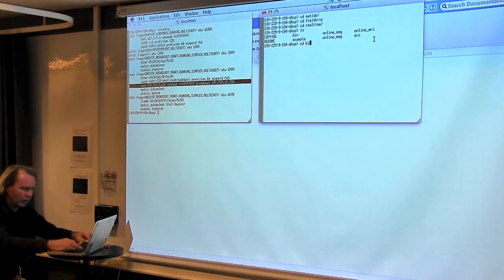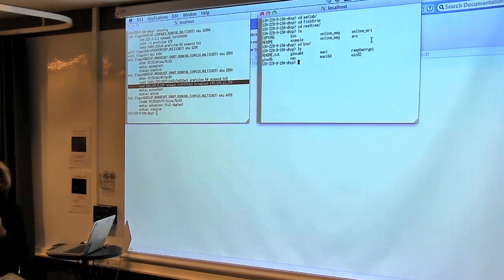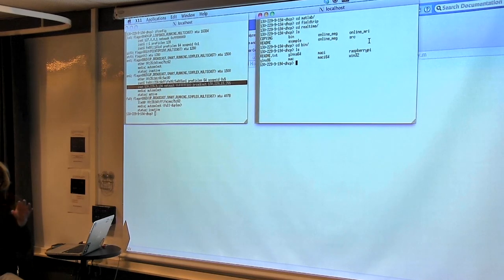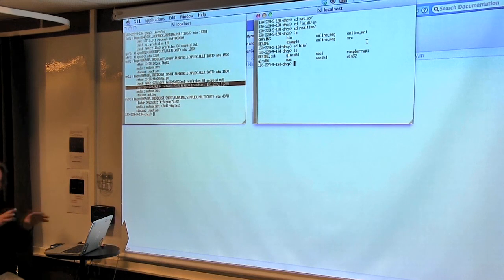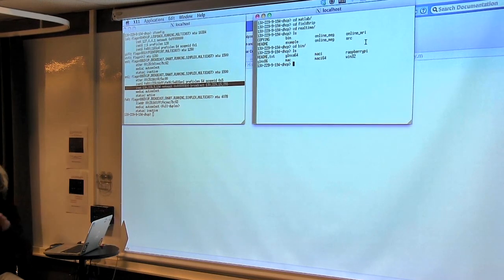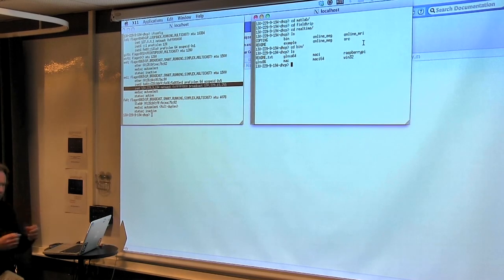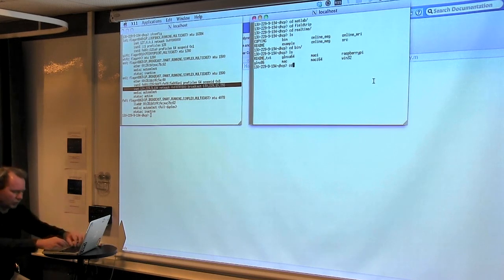In the bin directory, there are binaries that are compiled for various platforms. For us, it's really important that we can run this on different types of computers. Our acquisition computer is Linux. We do a lot of the analysis on Macs, but also a lot of the analysis on Linux. We're trying out certain things on Raspberry Pis, which are these really small computers that you can easily build into a project.